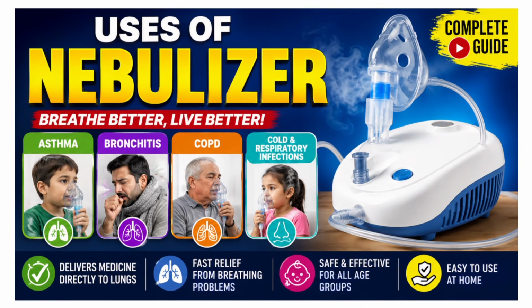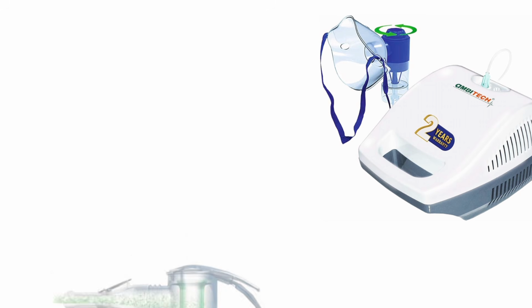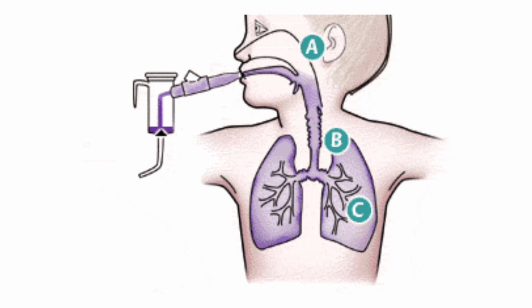In this video, I am going to explain about the nebulizer. A nebulizer is a medical device. It is a small machine that converts liquid medicine into fine particles like mist or aerosol, so that when we inhale these particles, they enter directly into the lungs.